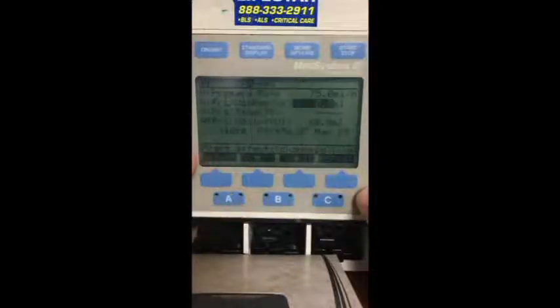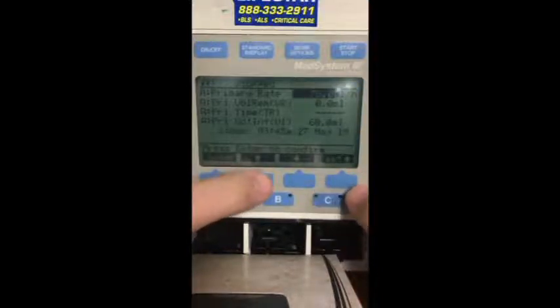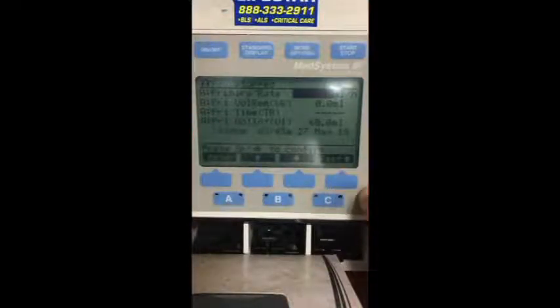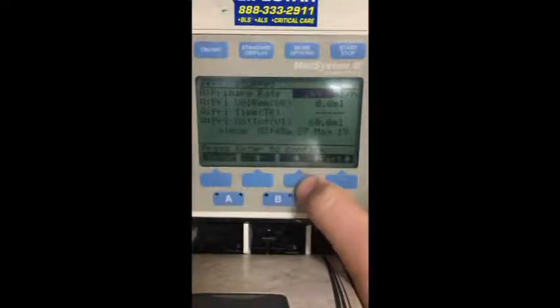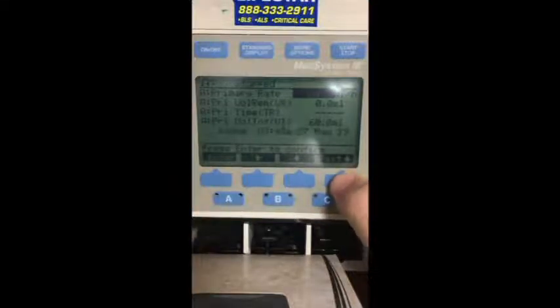If we go in, your select button is kind of your arrow key and it runs only up and down. Here we can input. You can go up individually, or you'll notice that the fast key is there and you can jump fast. Well, I wanted 225. Now I hit the down key. Oh, I went past it. Notice it's fast down now, so you can jump down fast. Up, fast up.